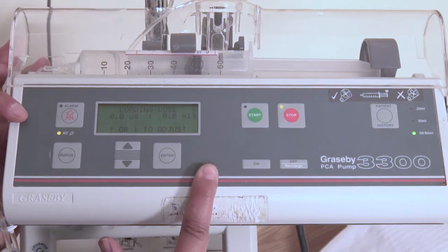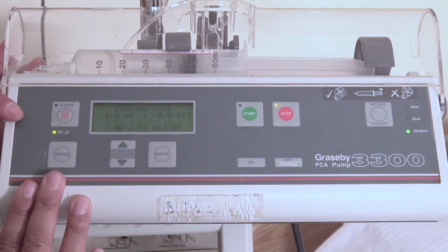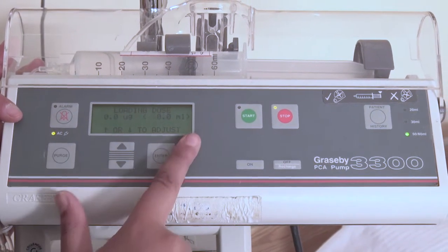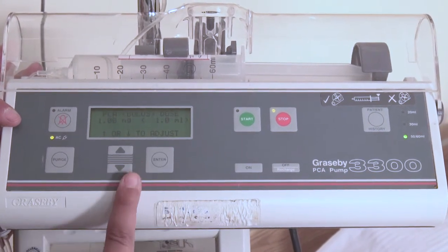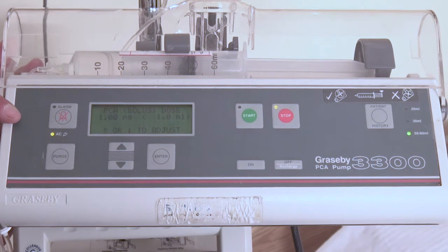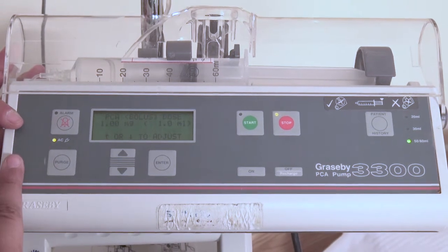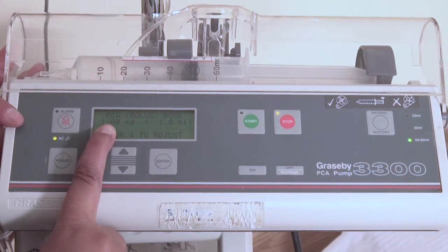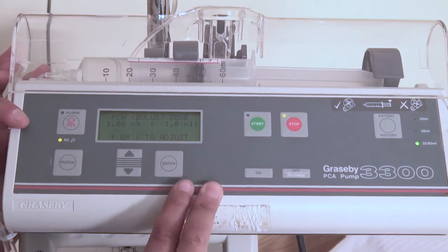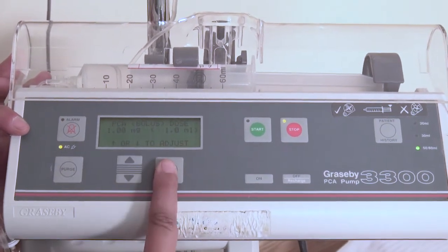Now my loading dose, again, if you'll remember on your orders and on the PCA, I don't have a loading dose, but this is where you would enter a loading dose so that it would give a bolus to the patient. Since I don't, I'm going to keep it at 0, and I'm going to press enter. My PCA bolus dose is the dose that I'm actually administering whenever the patient presses the button. Each time the patient presses the button, they're going to get a dose. That's the 1 milligram, and that's 1 milliliter, which makes sense because it's a 1-to-1 ratio in the syringe. You can press up and down based on what your orders are. This is 1, so I'm going to press enter.